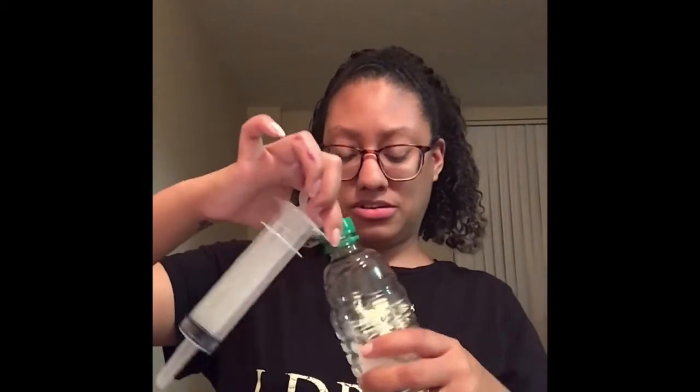So we're going to open our solution, pour it in, making sure you palm the label like always. We are going to put our syringe back in. At this point, you are going to put gloves back on.